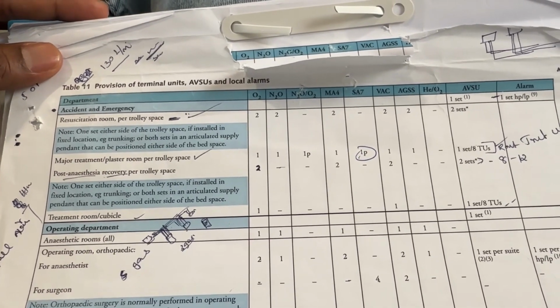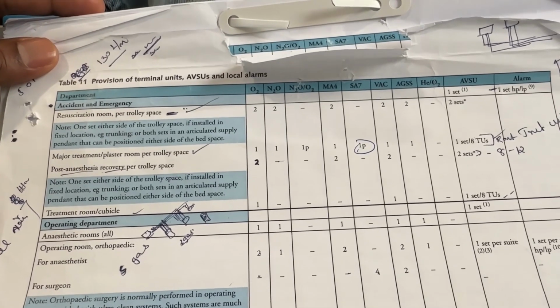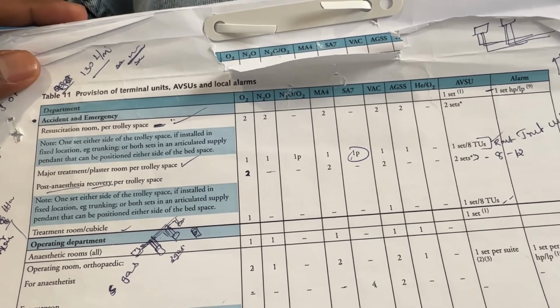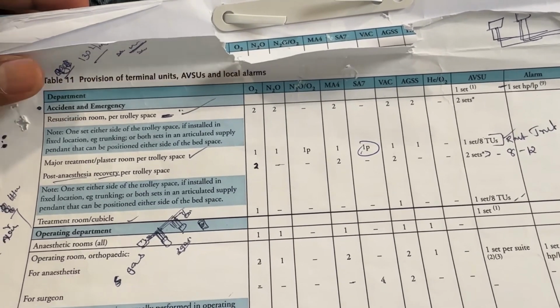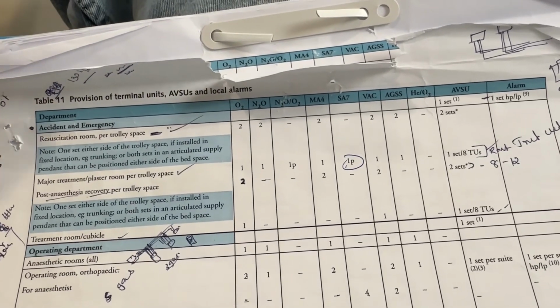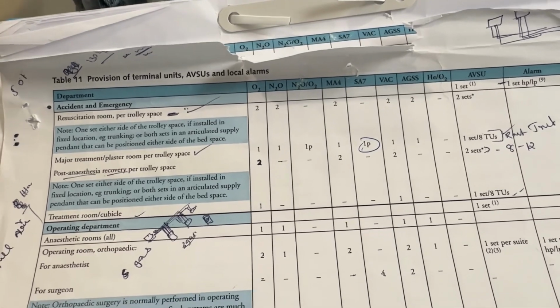Today we are talking about the medical gas terminal unit as per HTM, table 11, page number 15. The first department as per HTM is accident and emergency. We can see how many outlets we can provide for each room.